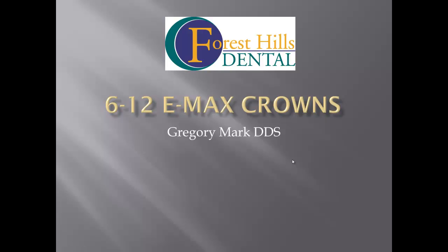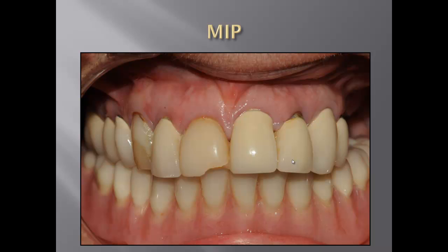Today I would like to share with you some clinical tips that I've been presenting in this case. This patient came to my office with a chief complaint that she has multiple cavities, she doesn't like her bite, she doesn't like the appearance of her front teeth, and her front teeth started chipping. From the dental history, we found out that the patient doesn't have a stable bite.